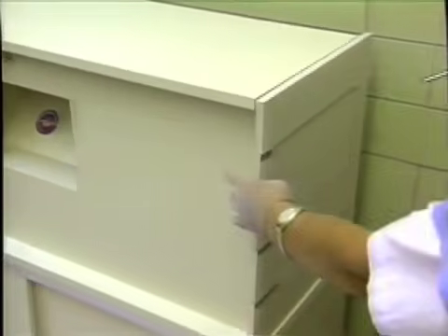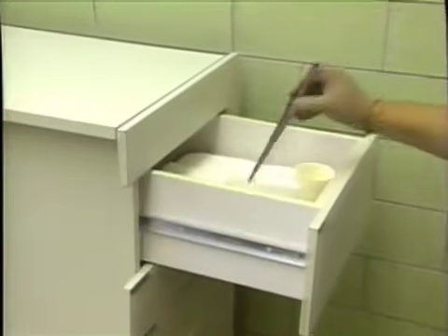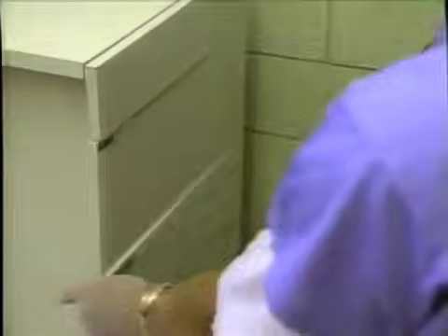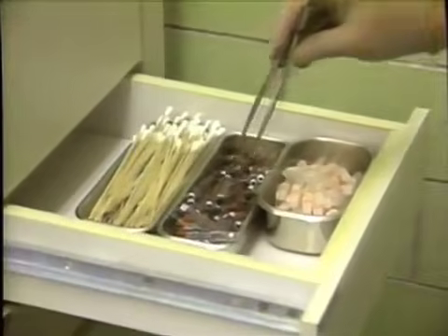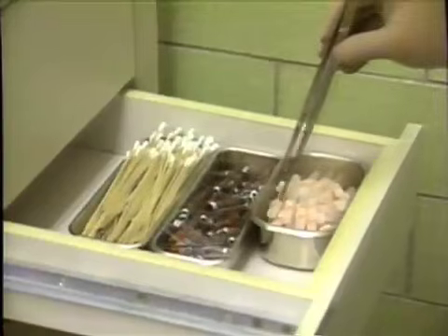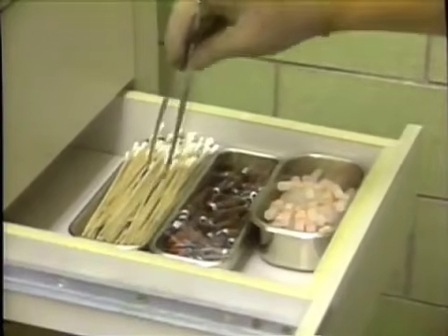Transfer forceps is provided to transfer the sterile sponges to the bracket tray. It is also used to transfer the anesthetic solution, the needle, as well as the Q-tips.